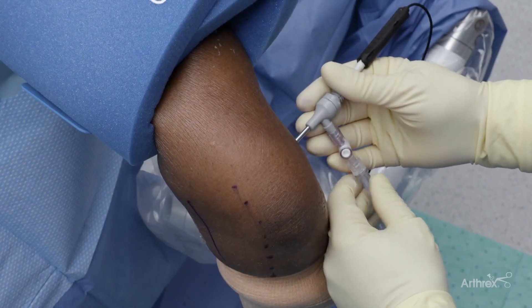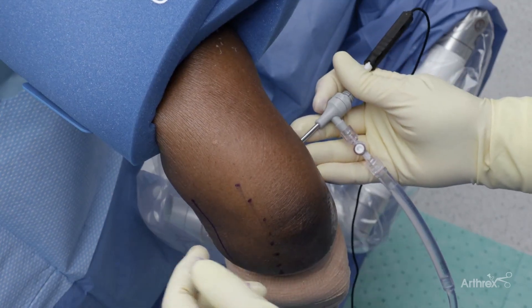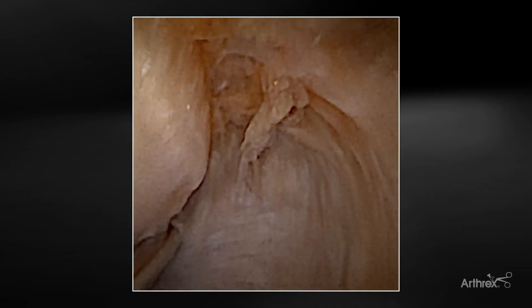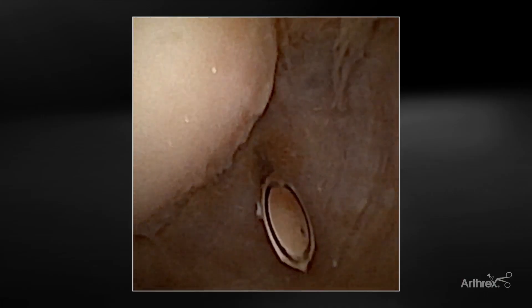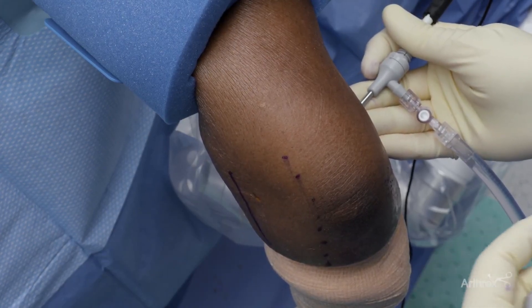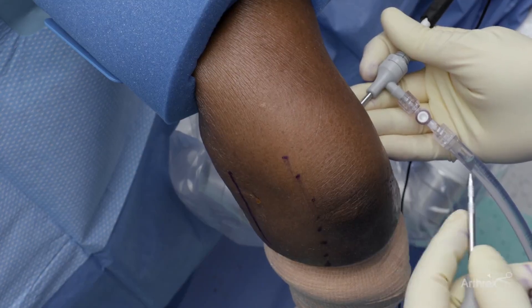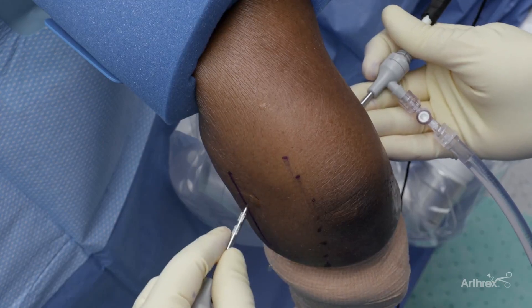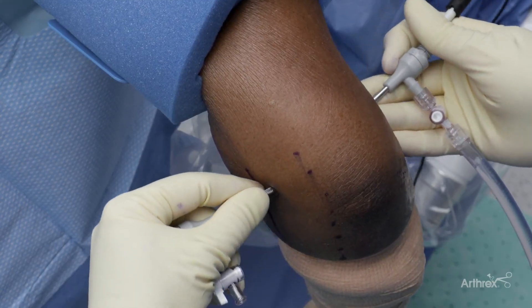We like to start with our ulnar portal, first checking with a finger, then with a needle. You can easily make this portal — you can see that we're anterior. I usually just make a little stab incision with an 11 blade. One of the things about nanoarthroscopy is that most of these portals can even be closed with a steri-strip.